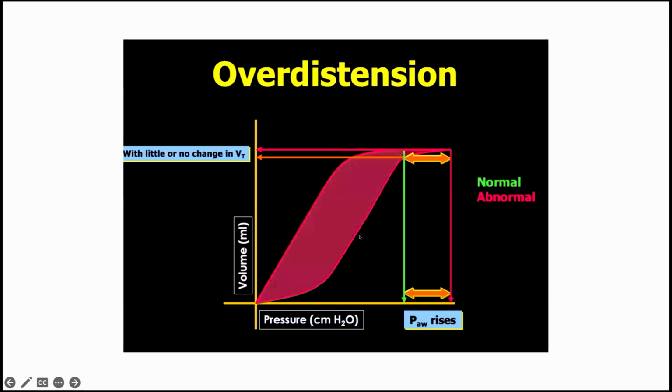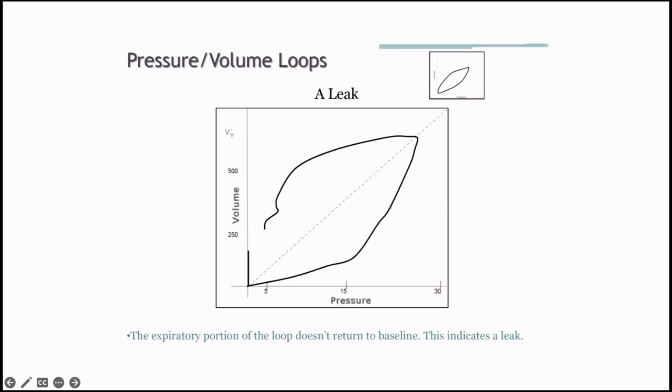And the same thing is depicted in another graph. This is again over distension. You can see that this part is just beaking or plateauing. This is again one classic description, and many exams will directly ask about it.